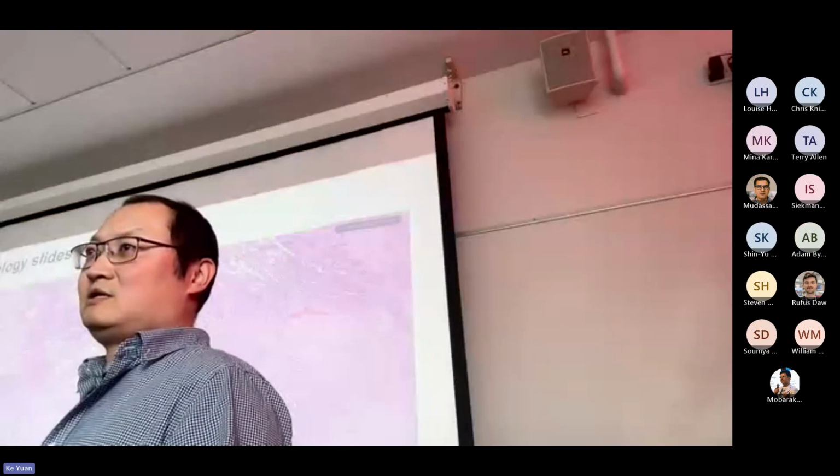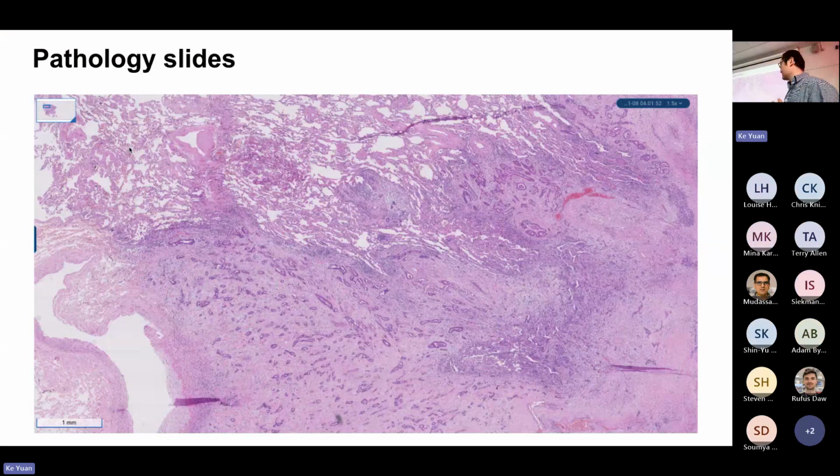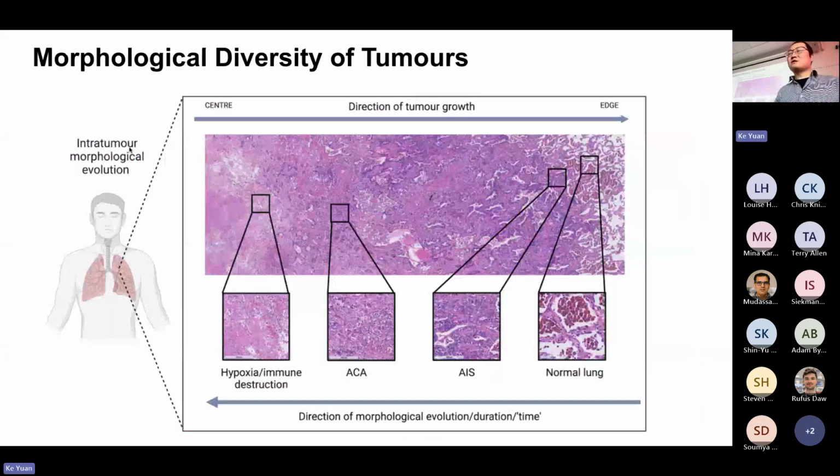About 1 million cells and their interactions with the local microenvironment and how they interact with each other. So here is an example of how heterogeneous and complex this information could be. Here I'm showing you just a simple example of a lung slide. And from there, you can see we're highlighting basically 4 different typical classical phenotypes.